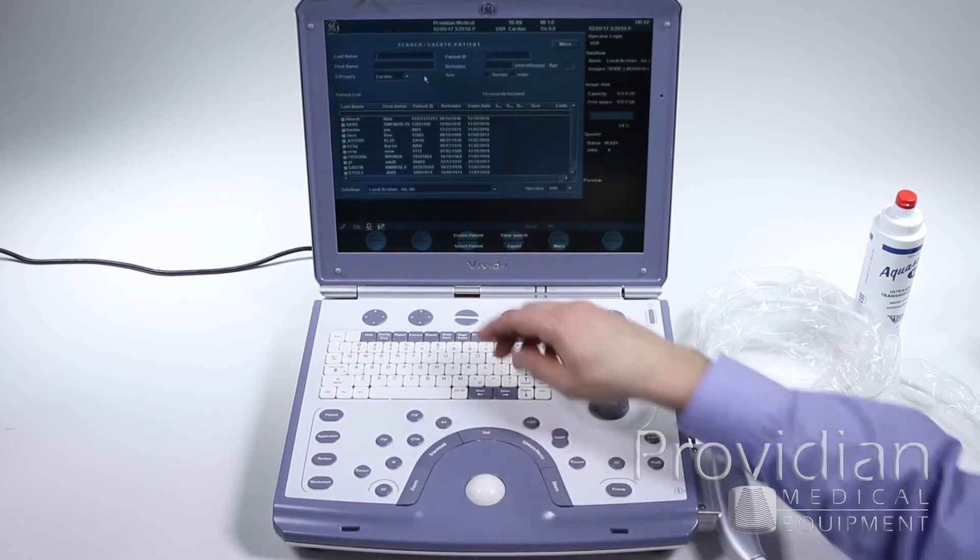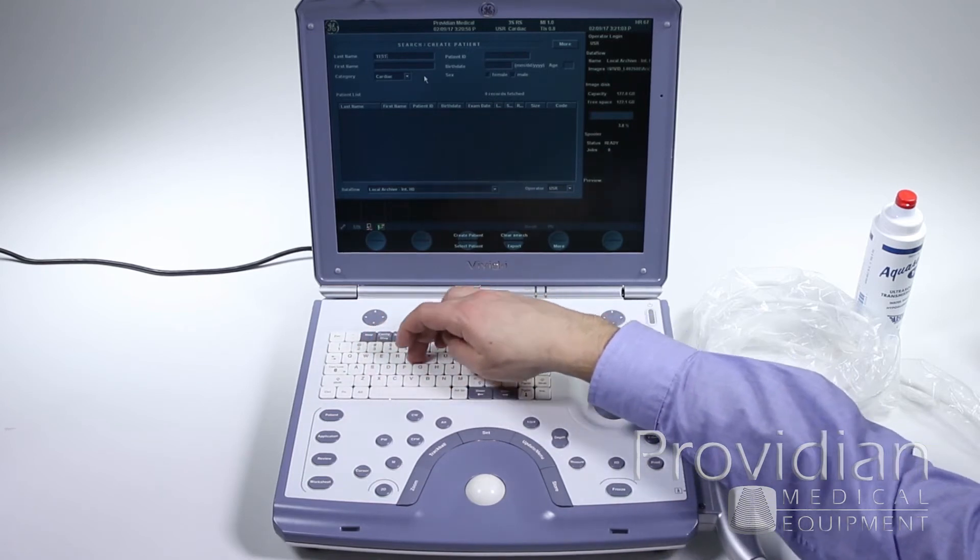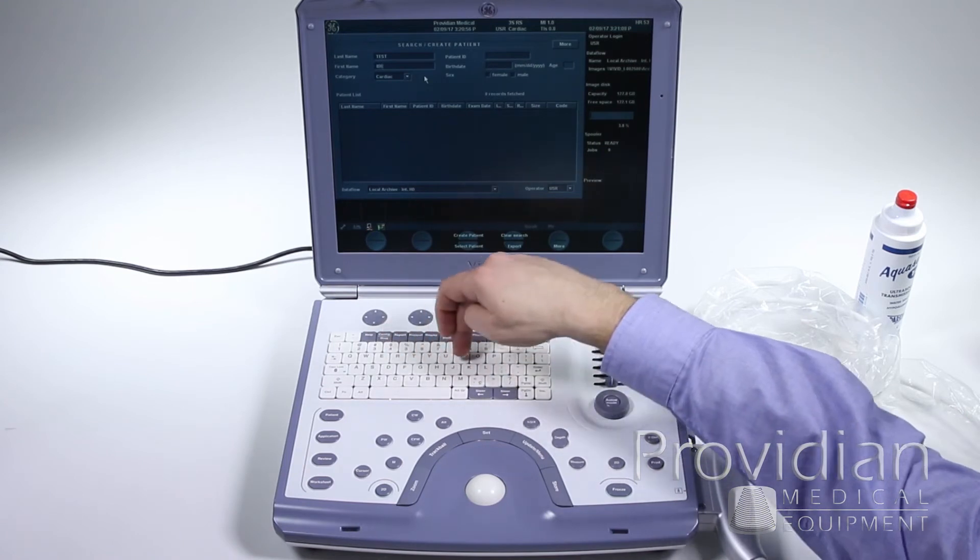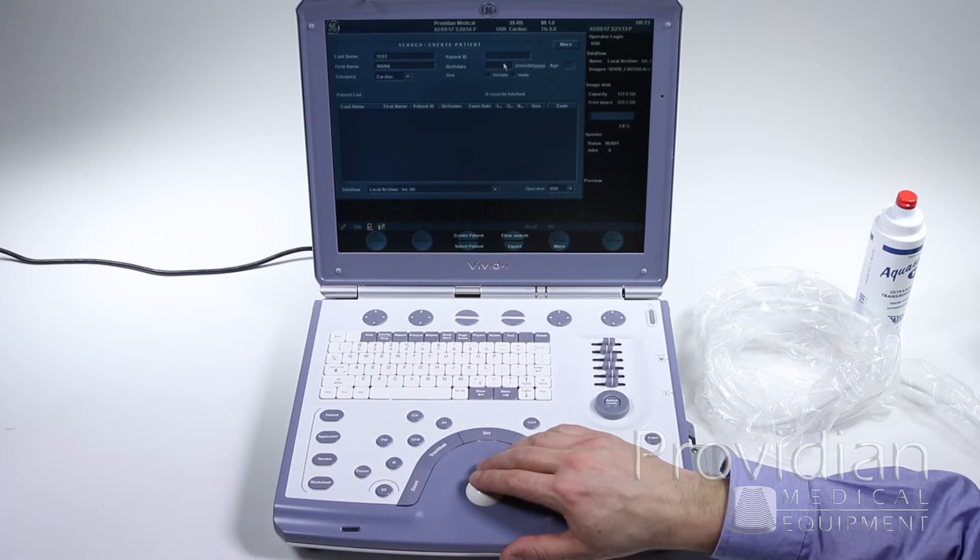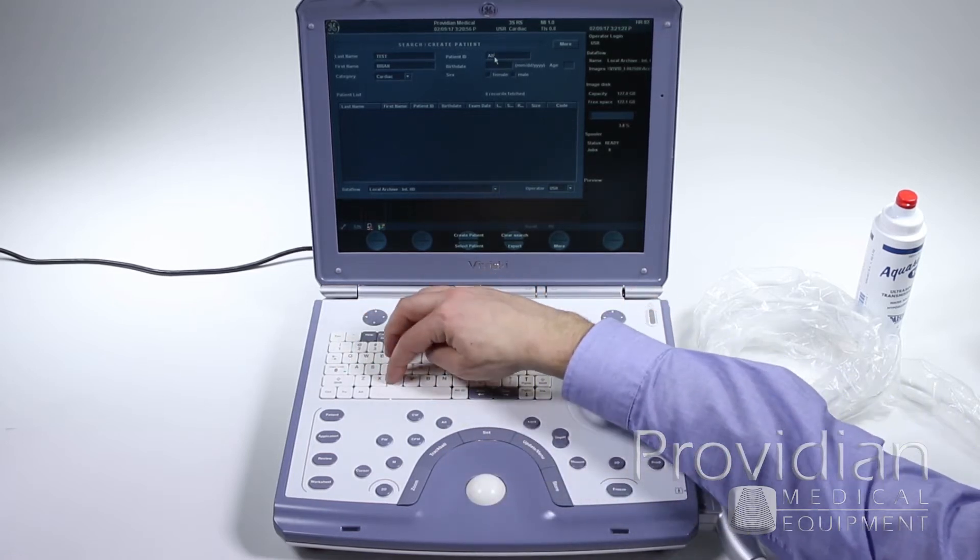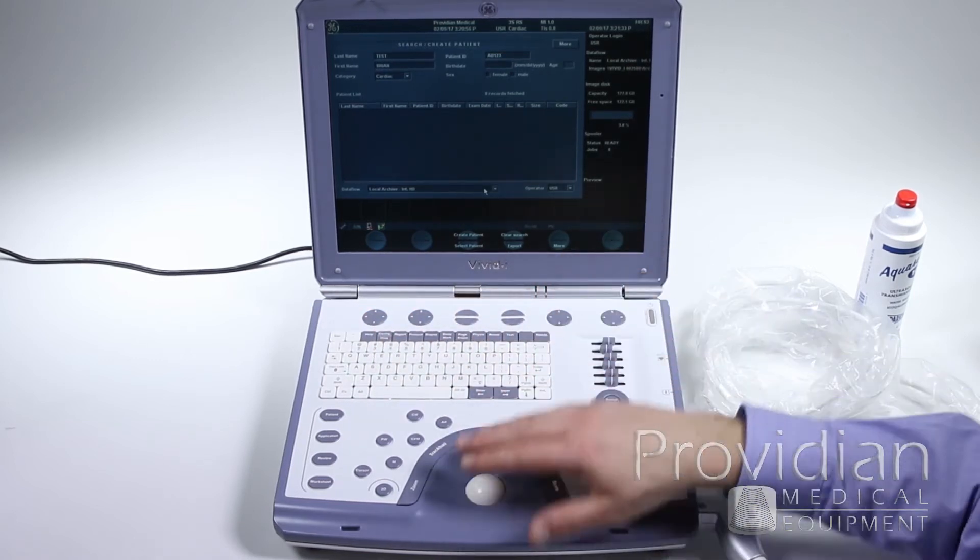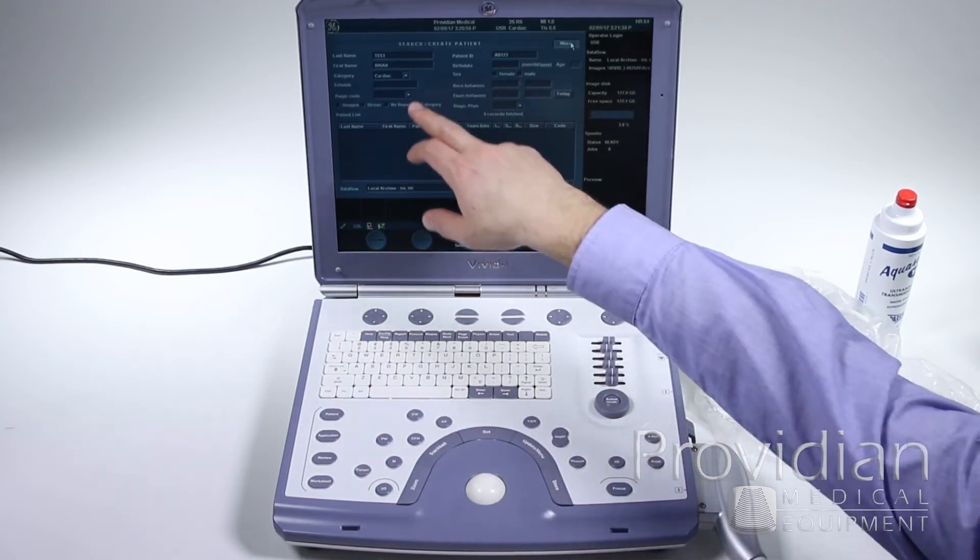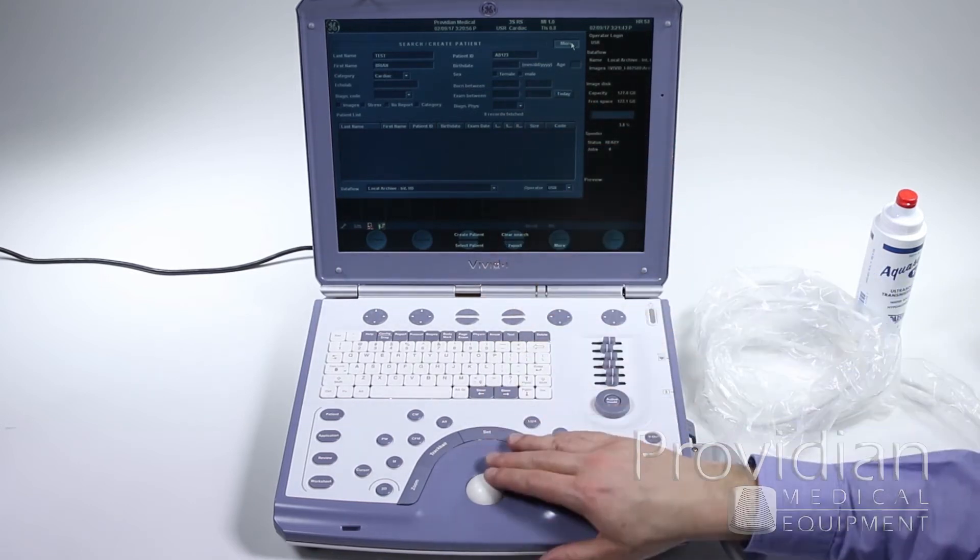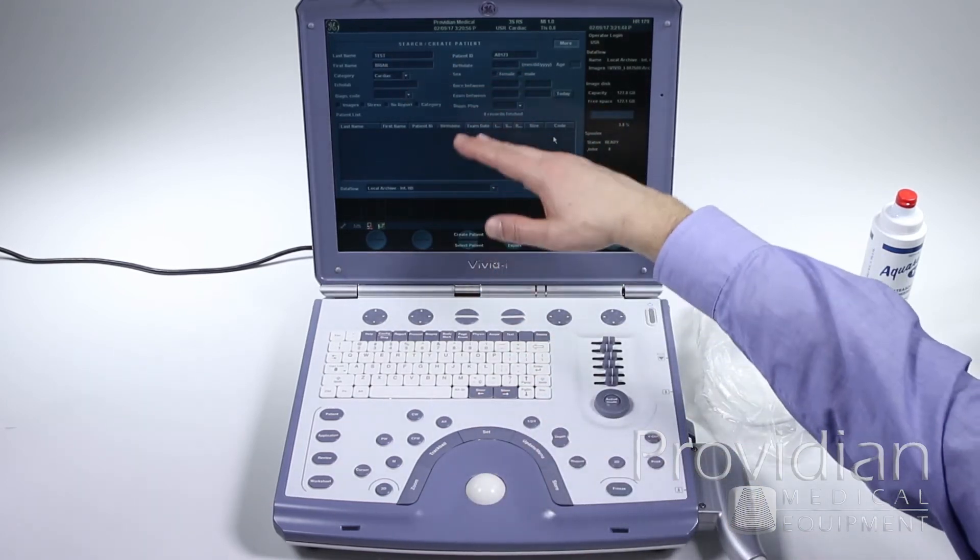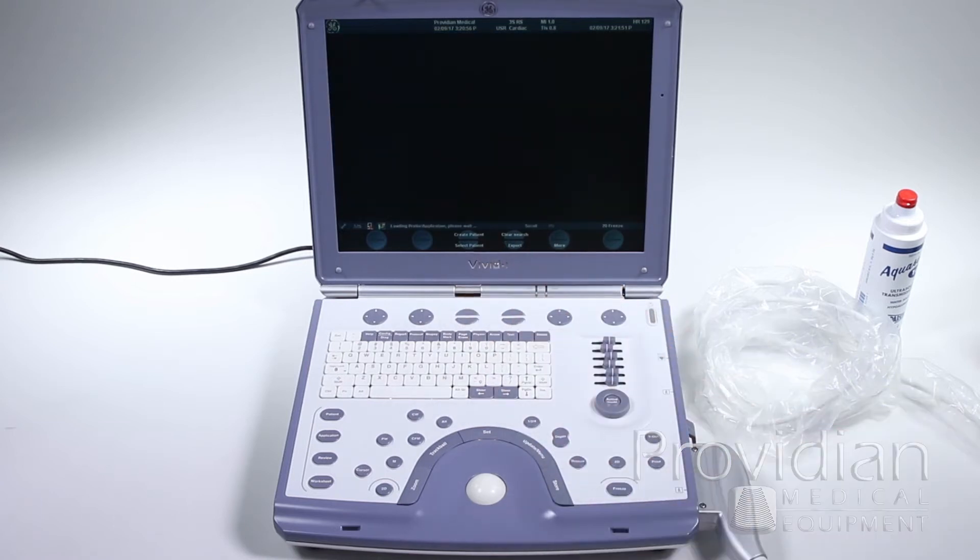I'll just type in some test information. Test, and I can tab to the next and say Brian. It'll ask me for a patient ID. I'm just going to go ABC one, two, three. Now I can go ahead and click create patient. There's also some more things here. If you want to click on more, if you're searching for a patient, there's some ways that you can search: born between, when you created the exam, the physician, and then it'll get all the people that way. But if you've typed in the information there, nothing will show up unless it's a previous patient. So I'm going to go ahead and create that patient and I'm ready to begin scanning.